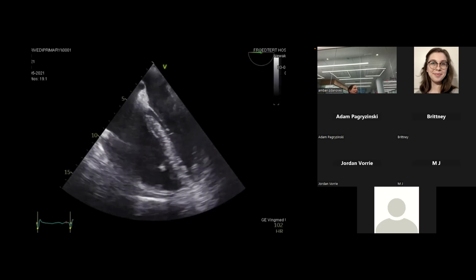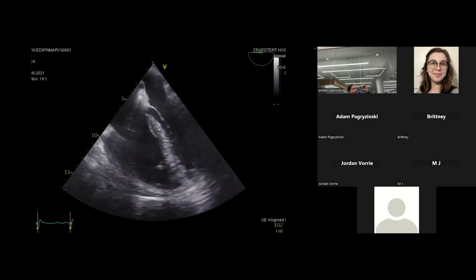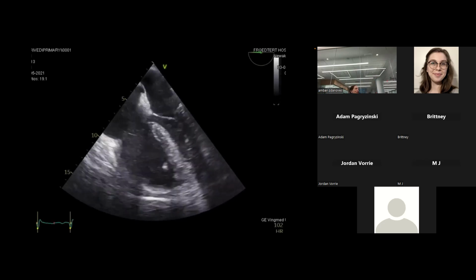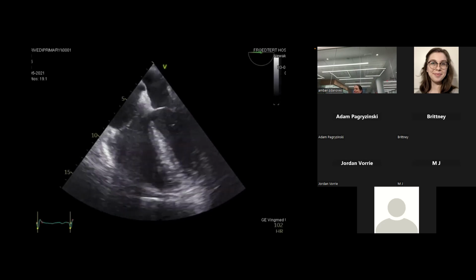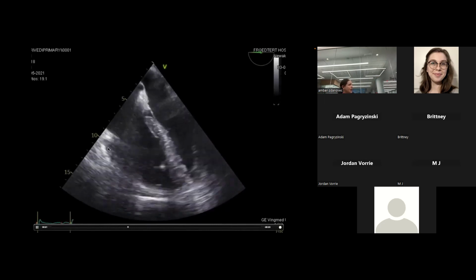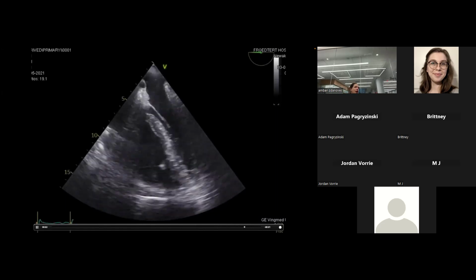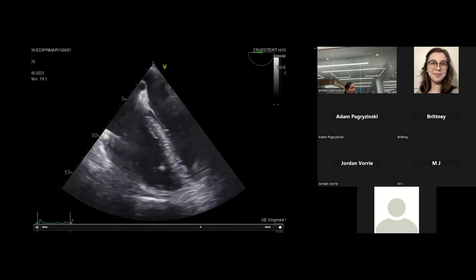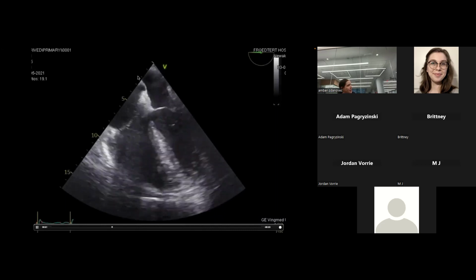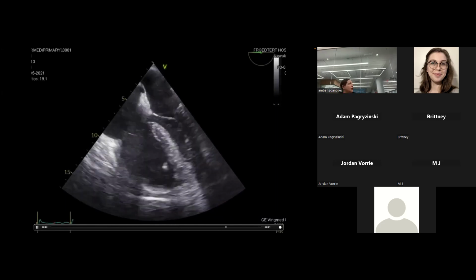So again we're back at our four-chamber mid-esophageal view, and what do we think? We must have been short on probes this day because this is the terrible probe in the unit. How do we think that RV looks in comparison? Sad. Not happy. Yeah. So actually, there's still somewhat decent movement of this tricuspid annulus, but you can see it's much bigger than the LV. And at most, the right side should be about two-thirds the size of the LV. So you have a big RV and an underfilled LV. Also, if you look at the septum here, is it midline or is it bowing? It's bowing. So that shows there's a pressure overload on that right side.